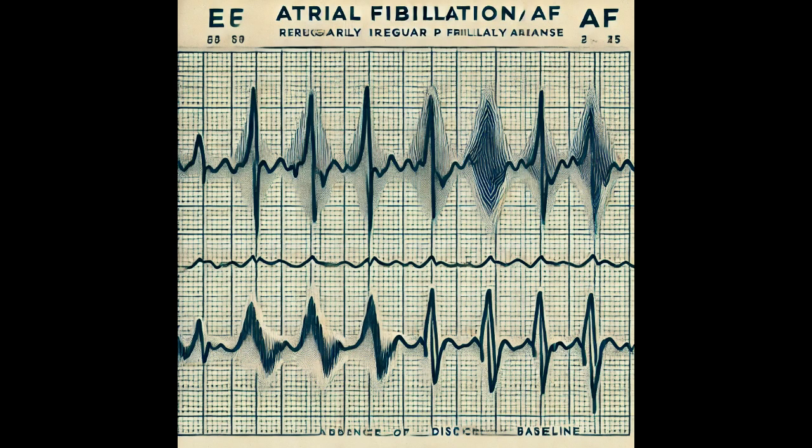So those squiggly lines tell us a lot. They do. And the best part is, an ECG is a pretty simple test. Non-invasive. Right. Yep. And relatively inexpensive, too. So if you're having any weird heart symptoms like palpitations or dizziness, definitely talk to your doctor about getting an ECG. It's a good first step to figure out what's going on.